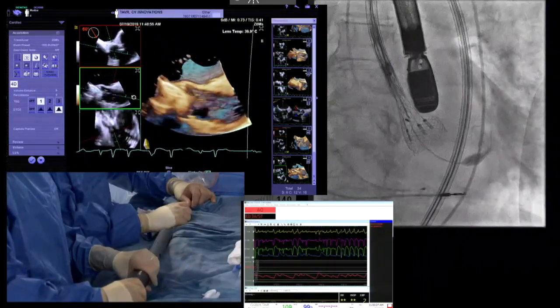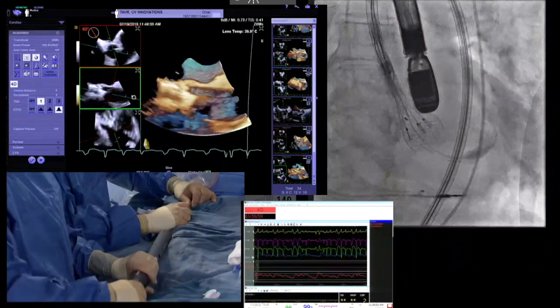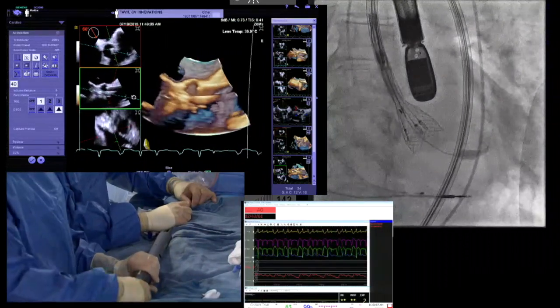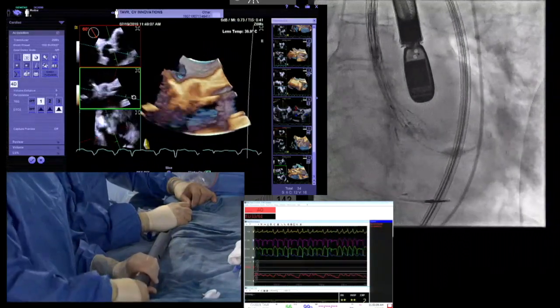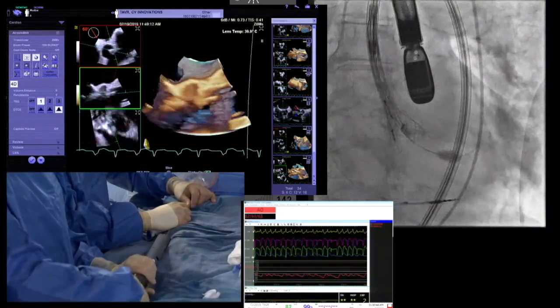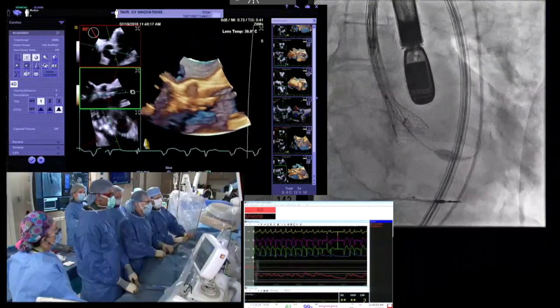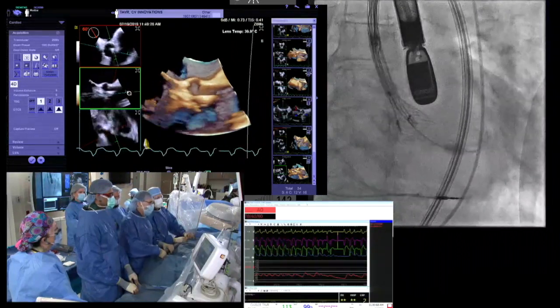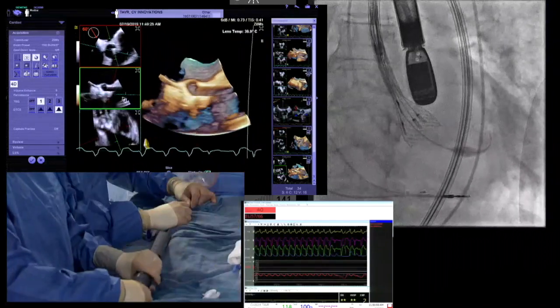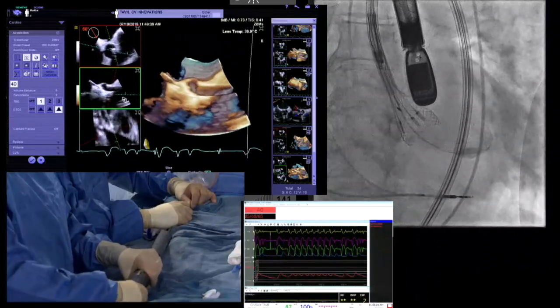So the valve was functional immediately, but what just happened there is we dove deep, even though we should have been starting to grasp. Don't like where it is, so you can see David's closing up a little bit, just until we release from the anatomy and can reposition back a little higher. So right about there, I think. Okay, so that's a partial resheath, and that's sort of the mulligan factor on this. You get more than a couple partial resheaths. You get a number of partial resheaths. Again, we looked a little deep on echo initially there. We still have a little bit of depth on echo. Okay. Pace faster, please.